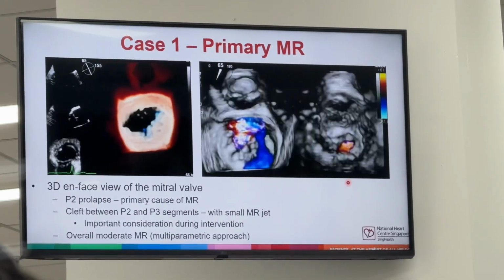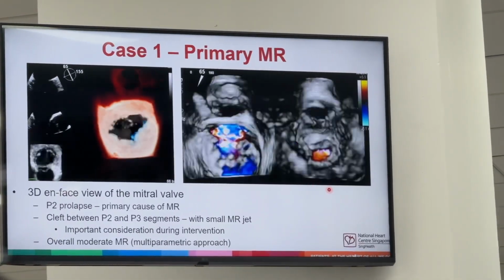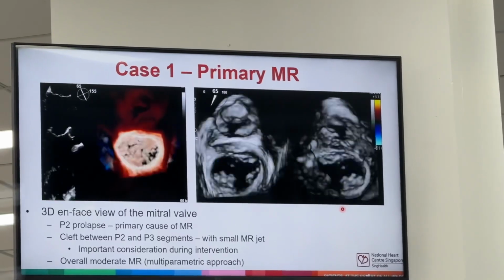And using a multi-parametric approach, we actually concluded that this is only of moderate severity, and we follow up the patient further with imaging and monitoring.